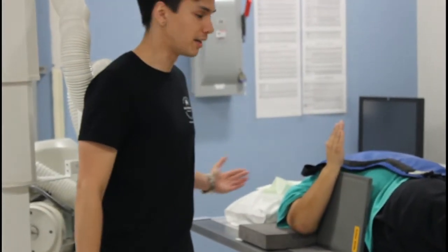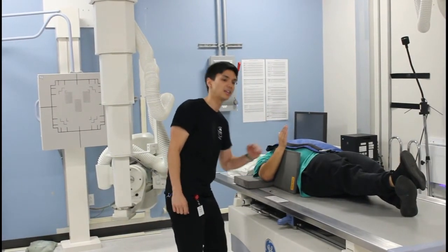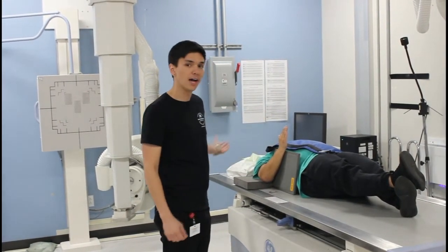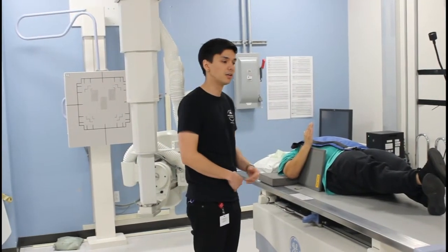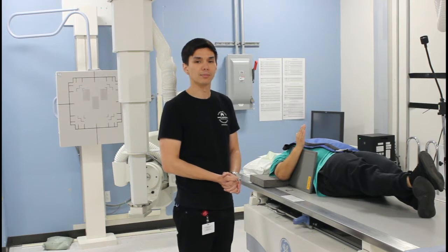And so, continuing, we are angling that arm at an 80-degree angle instead of the 90 on top of a 45-degree CR angle going caudally to elongate that coronoid process.